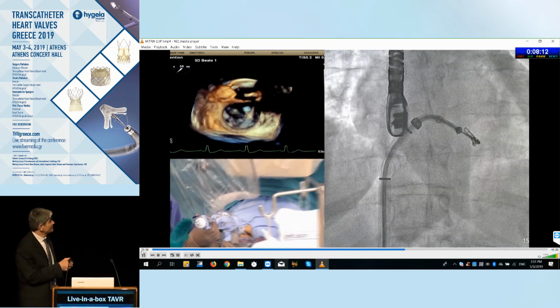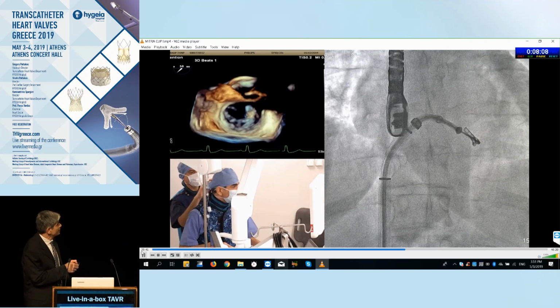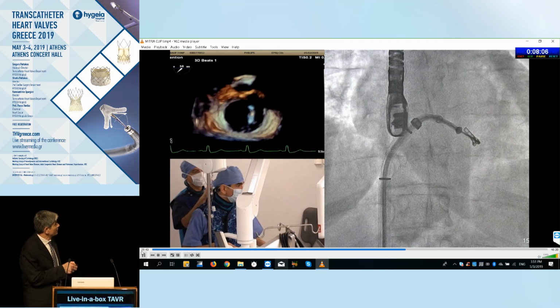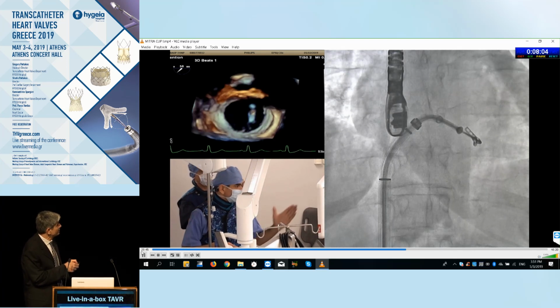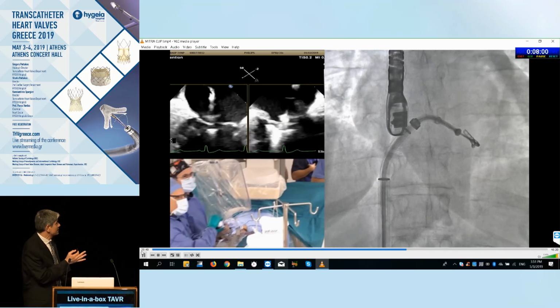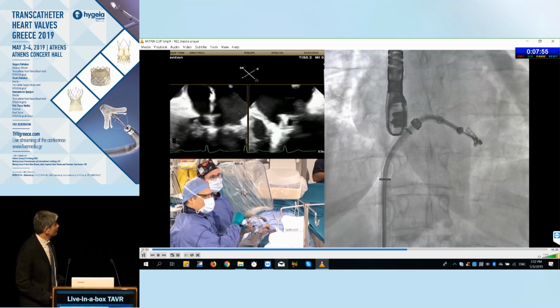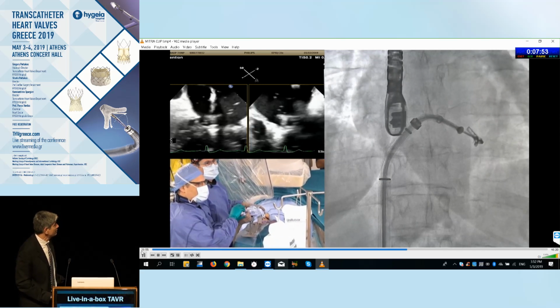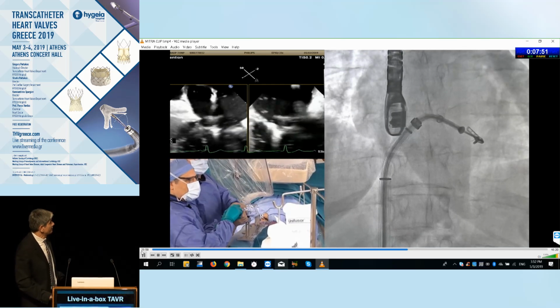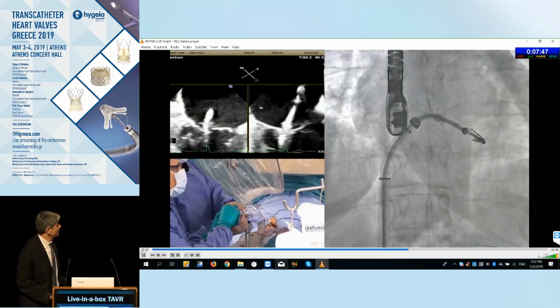And here we have advanced into the left ventricle. Here we see the device through the mitral valve, and we bring down the gains. We can reassess the perpendicularity, which appears to be probably okay, or maybe slightly clockwise. But here we have our first grasping. Both leaflets are on, and we can see the grippers falling down and closing the arms of the device.